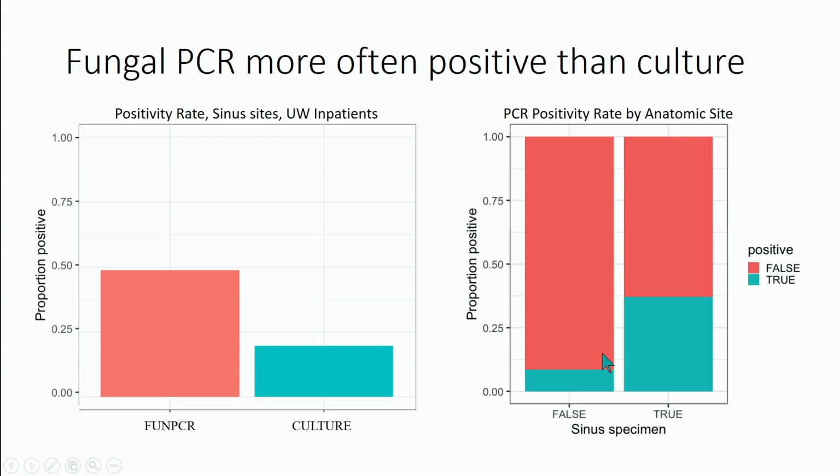And so the way I make sense of this, particularly now that I've had a chance to sign out a bunch of these cases and review the pathology reports that come in with them, is that there are a lot of specimens, particularly in the non-sinus category, this is all sites, that come in with granulomatous inflammation. It's a nice, dense epithelioid granuloma, and the suspicion is sarcoid.